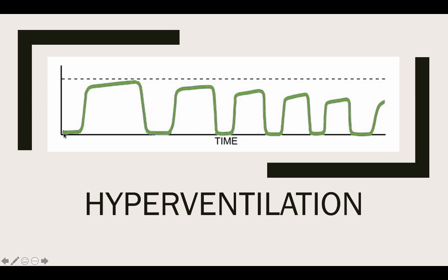But we're still worried about our alpha and beta angles, and our alpha and beta angles are remaining consistent. They're remaining constant. So the wave looks the same. It's just shorter in a temporal sense.